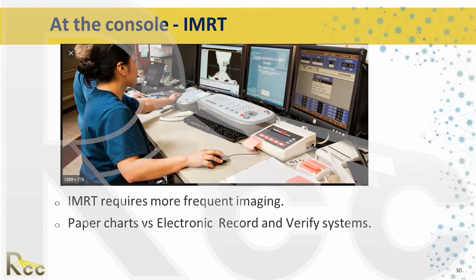And the second therapist should just be confirming, this is what imaging we're doing today. So whether it's OBI images, MV, you should make sure you're both on the same page before you start treatment. And also making sure that the first therapist, the driving therapist, is paying attention, watching the patient. If the patient moves in this kind of treatment, their PTV will be shifted and a critical structure can get irradiated. So it's even more important that the patient is really still.